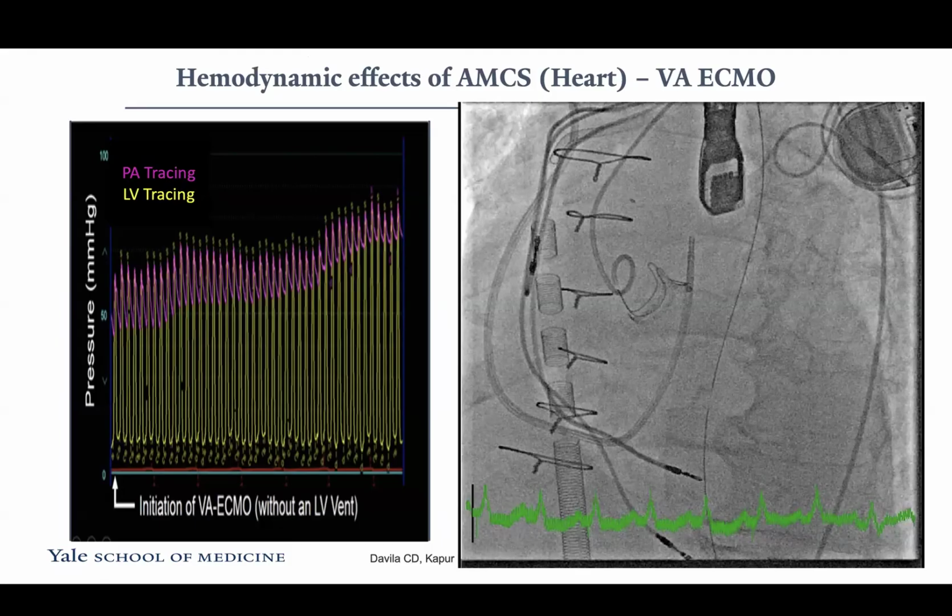So I saw the angios for someone who crashed on ECMO recently that needed a PCI on ECMO. And if you see those angios, you can see the mixing cloud. You see contrast staining in the cusp, right? So that's your mixing cloud. You're right there at the heart. That means that heart is not being vented. So probably that patient needed venting.